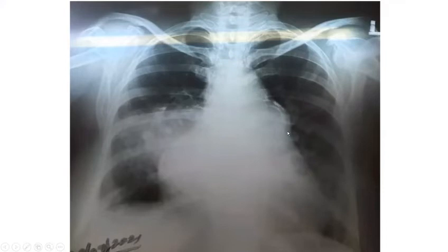Please carefully look for this calcification, because ductal calcification is something which, if it is present, you should be able to pick up, and it is suggestive. If the patient is having pulmonary artery hypertension, then you can always think of the possibility of Eisenmenger syndrome due to patent ductus arteriosus.